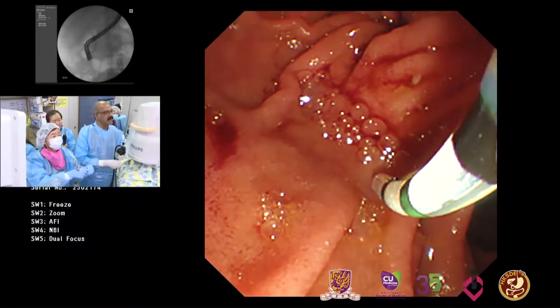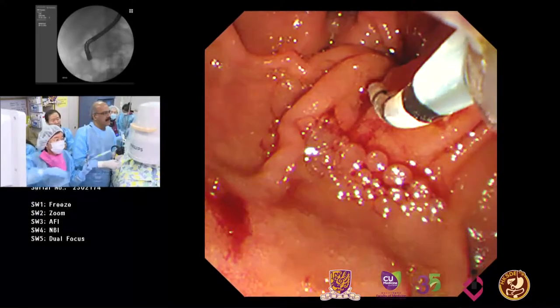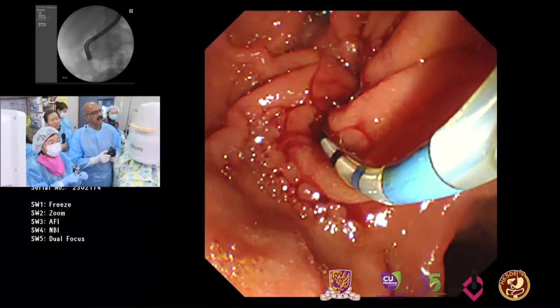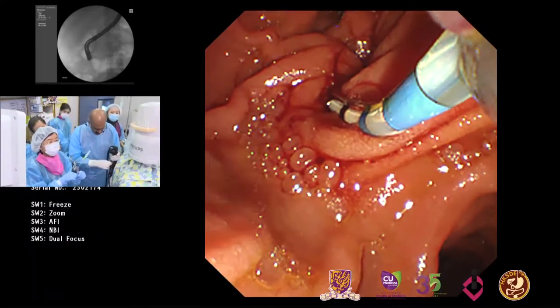As you get close to the papilla, you have to turn a little left, and that's when the scope can get slippery. So now I come, try and get very close, and again, when the sphincterotome goes inside, I try to turn my scope to the right to keep it stable. So Esther, can you push the wire? No? I'll just fluoroscope also.